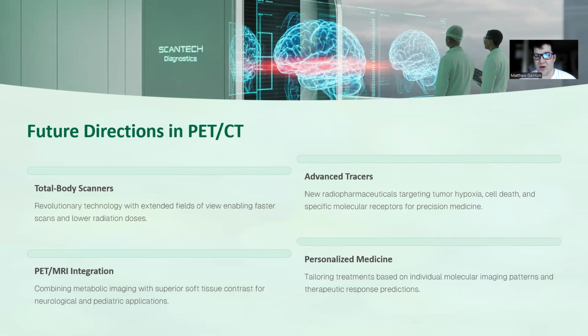So I know that on the radiopharmaceutical side of everything, they're advancing new tracers and advancing new detection and treatment responses and all these things, and that's another thing we've learned about in our course. And PET CT is going to help out with that. It's going to be right there along with it because all those radiopharmaceuticals are going to be detected through PET CT or SPECT CT.